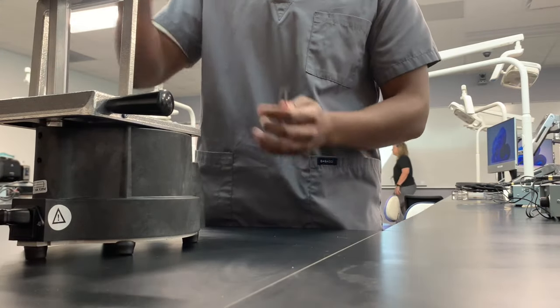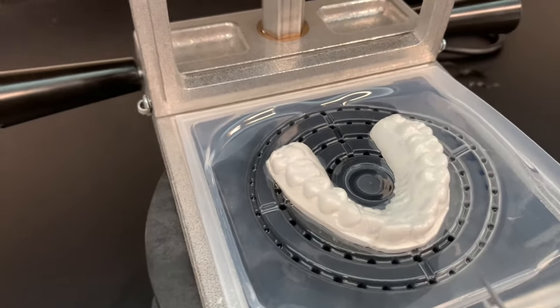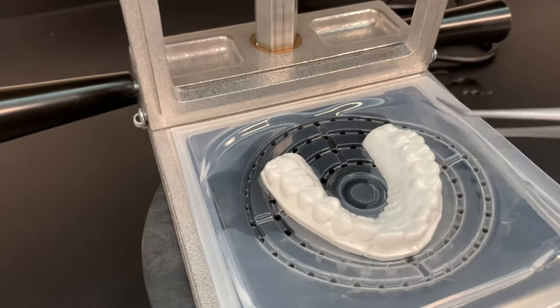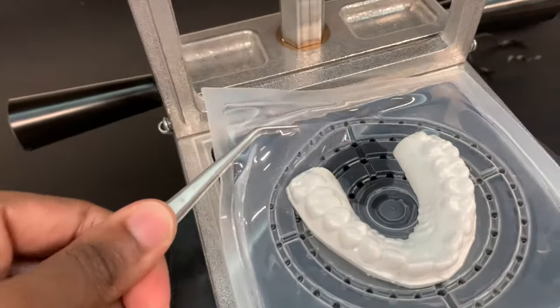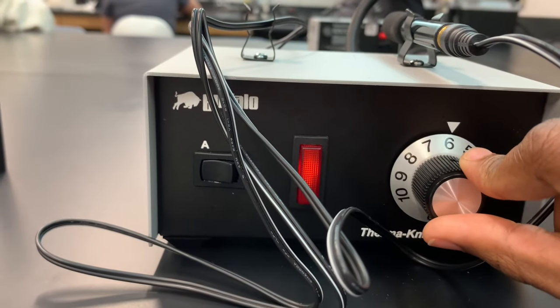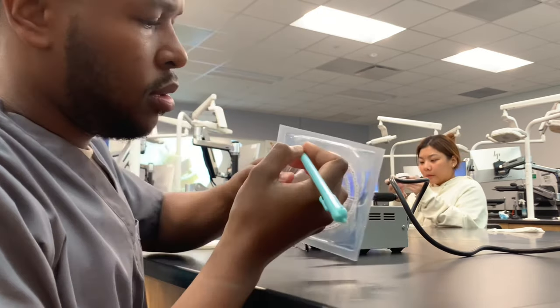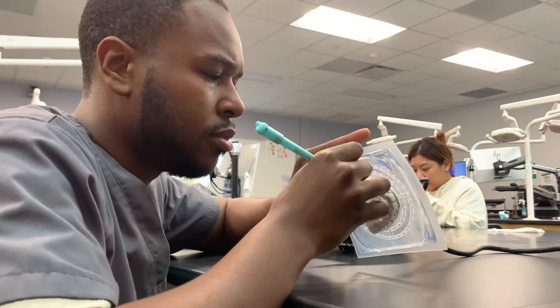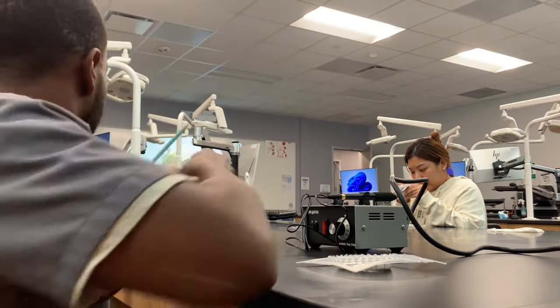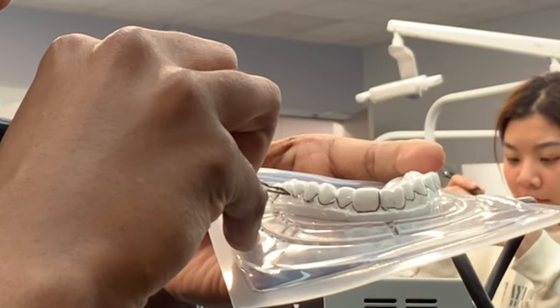Once we've vacuumed the vinyl acetate onto our tooth model, we remove it from the vacuum former using forceps, because it could still be hot. The next step is to trim it up so it can be placed in the mouth. To set up for trimming, I turn on my thermal knife, put it on setting six, and let that heat up. While it's heating up, I trace my gum line so I know exactly where to cut. Once I have a nice gum line traced on the entire impression, I follow those lines with my thermal knife. Super easy.